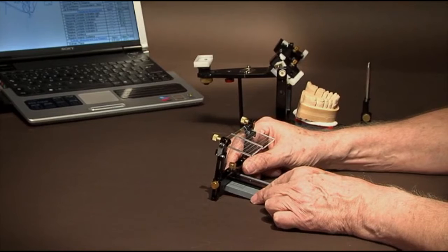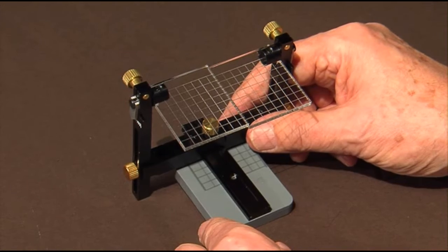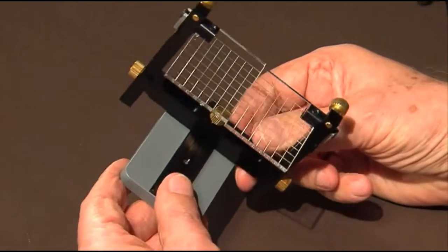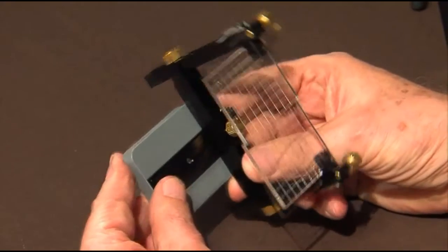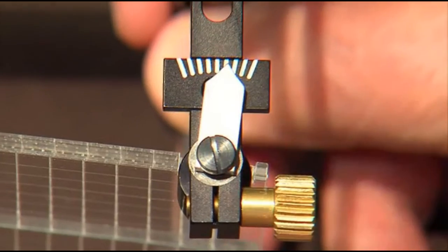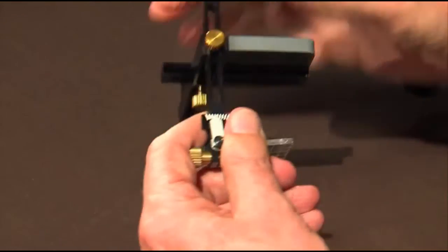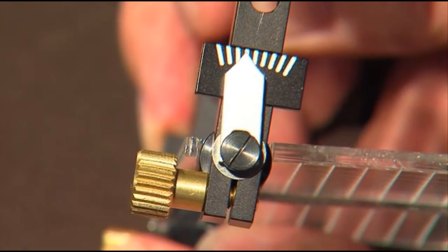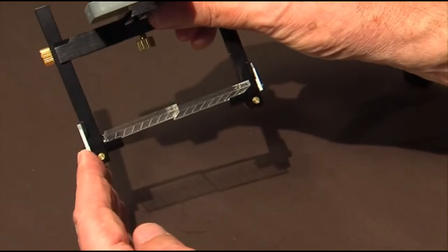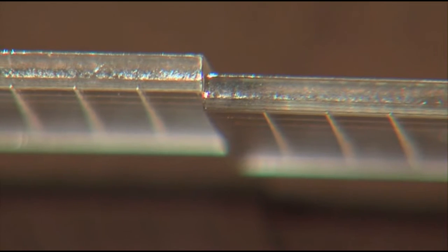The dynamics of the future occlusal plane is programmed with supplementary elements, the occlusal tables. More are required because we plan to distinguish between right and left due to the asymmetry. On one side, we programmed 6.5 degrees, on the other 5.5 degrees. This asymmetry is dependent upon the joint track. We also see slight spaces in the anterior area.